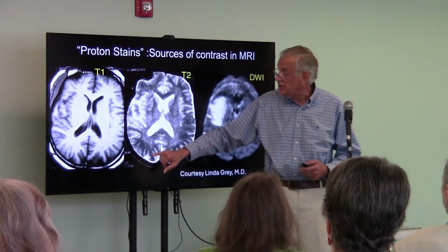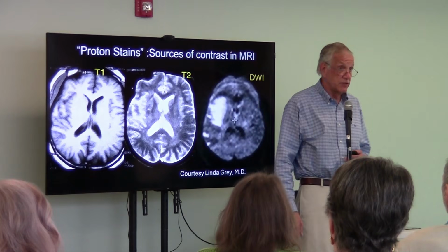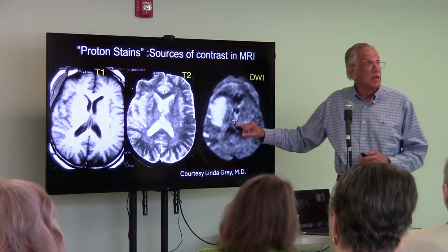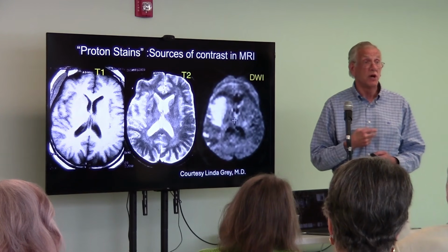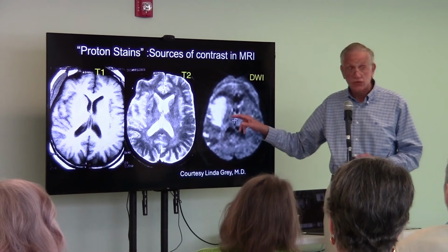And we're beginning to see differences in the gray and white matter tissue. But over here, a pretty crappy image. This is looking at the diffusion of water, and that's where we're going to spend our time today, looking at the diffusion of water. Turns out that the diffusion is a very sensitive thing to stroke.